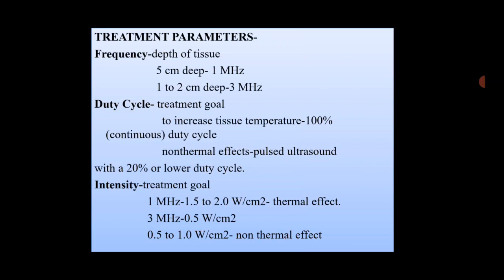Then coming to the intensity. Again, intensity also depends upon your treatment goal. If you want thermal effect, then for 1 megahertz frequency, you keep 1.5 to 2 watt per centimeter square. Then for 3 megahertz, you keep 0.5 watt per centimeter square. For non-thermal effect, you keep 0.5 to 1 watt per centimeter square.